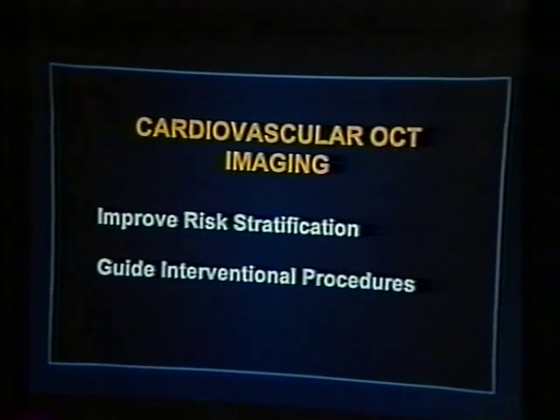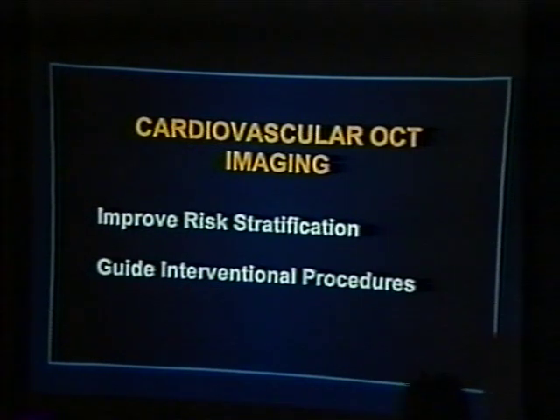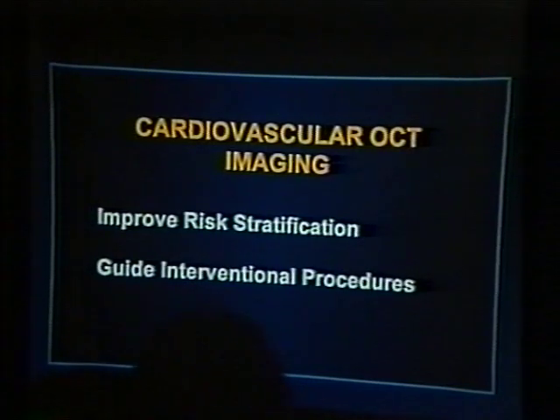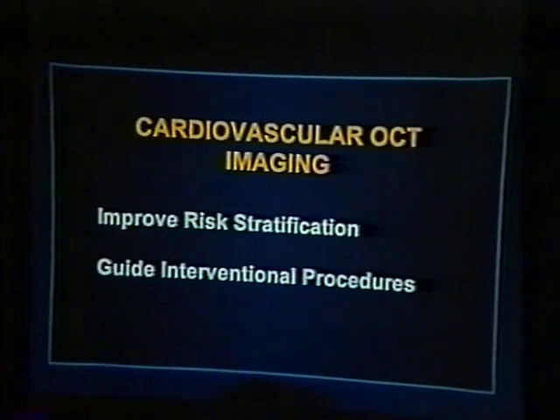I've been working with Jim Fujimoto now for 5 years on developing OCT for imaging in non-transparent tissue, and the reasons why we think it will be useful include its high resolution, which is currently between 4 and 16 microns, its broad dynamic range of 109 decibels, which is at the shot noise limit, its compact portable design, its fiber-based design, which allows ready integration with catheters and endoscopes that can be made very small. It's at or near real-time imaging. We're currently at 8 frames per second and believe video rate will be present in the near future. It's inexpensive and can be combined with other modalities.